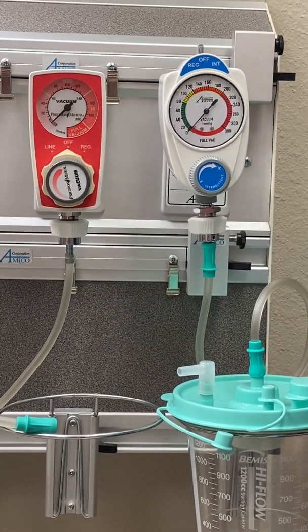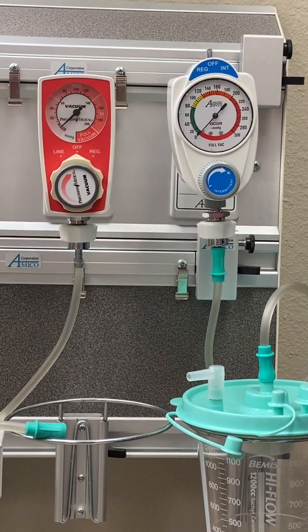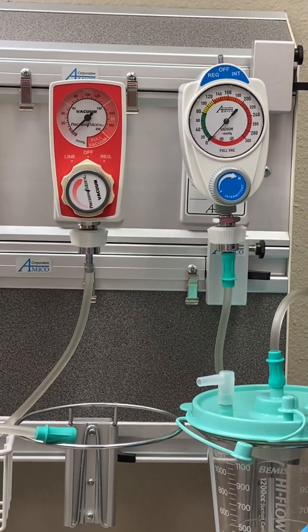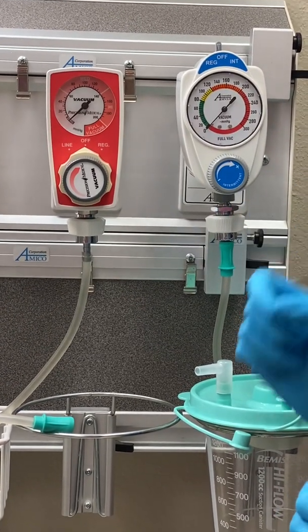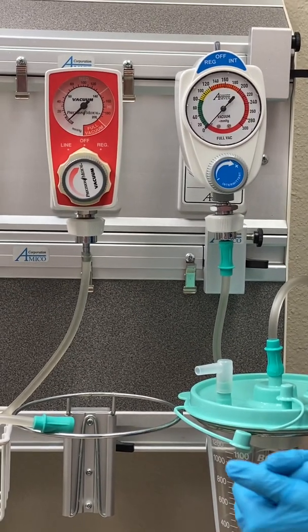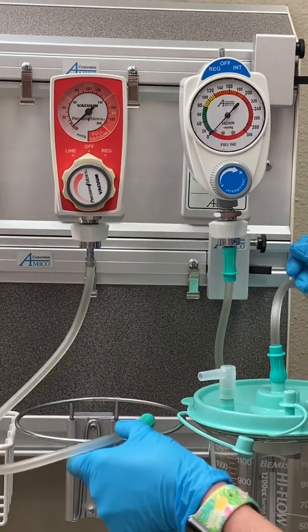Please keep in mind that when you are using a suction regulator in a simulation or at a clinical site, they may be a different shape, color, or have different functions. If you're unsure, be sure to check with your clinical instructor or the nurse that you're precepting with that day.